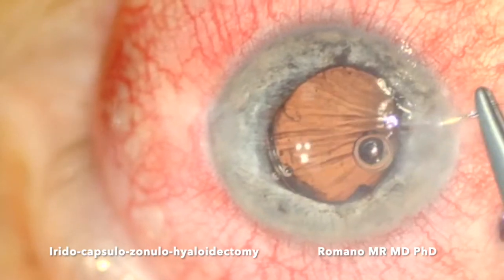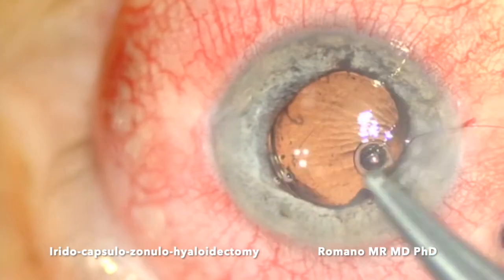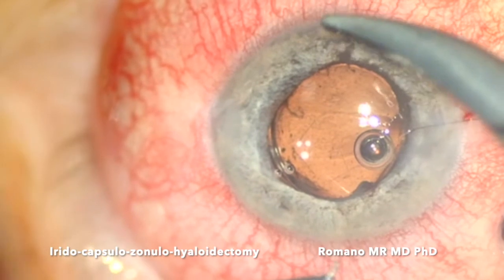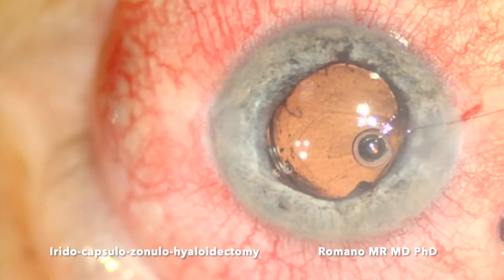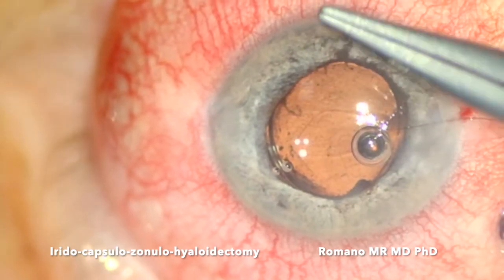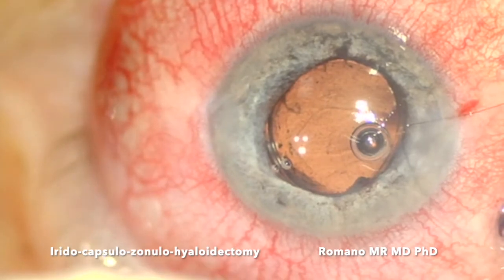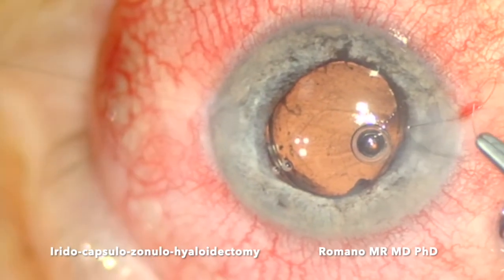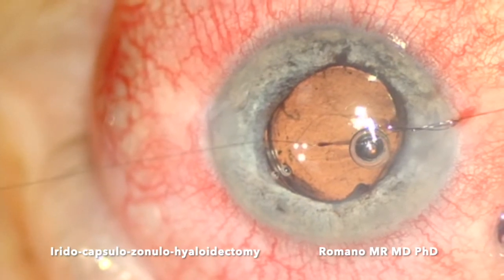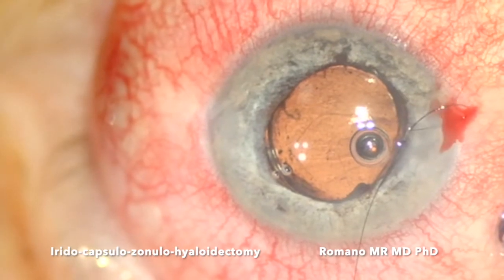I'd like to close it up because with the vertical incision you can have iris prolapse inside. This surgery is very simple and quick, and you can really get resolution of malignant glaucoma in almost all cases.